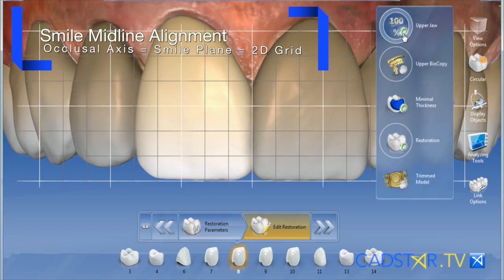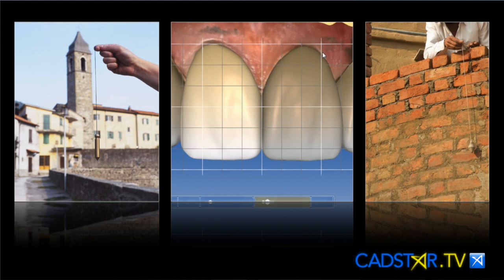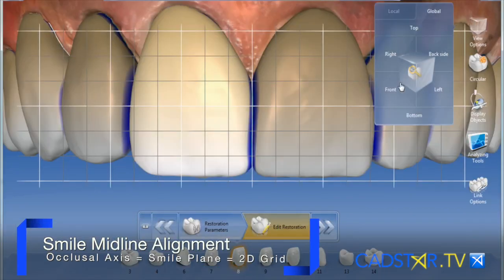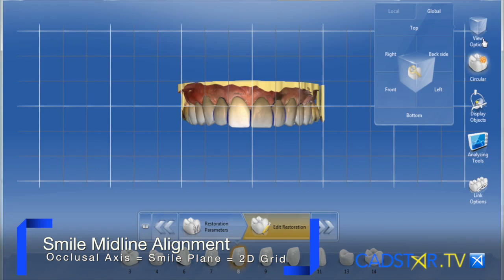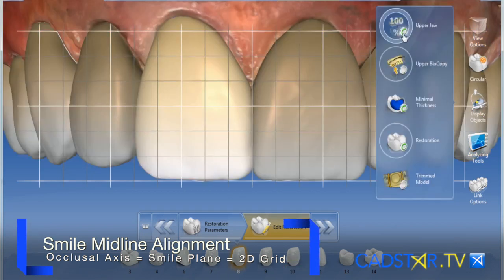When our model is set up to the smile plane, we can identify the vertical component of that midline, and it's really easy to design. So my process for easy design would be to choose either tooth 8 or 9, assuming that I'm crossing the midline. Using the model axis, setting it up properly, using the 2D grid with view options set to front — that will give me the position of my model to help me identify my vertical axis at the midline.